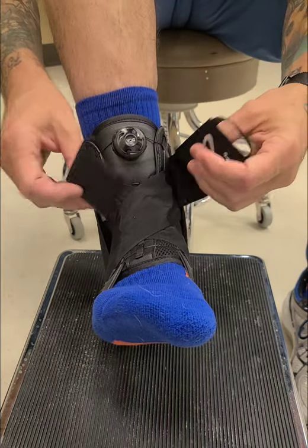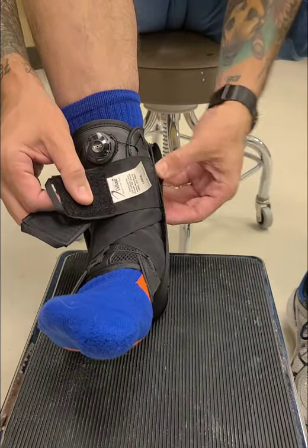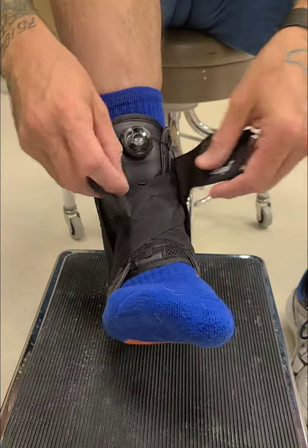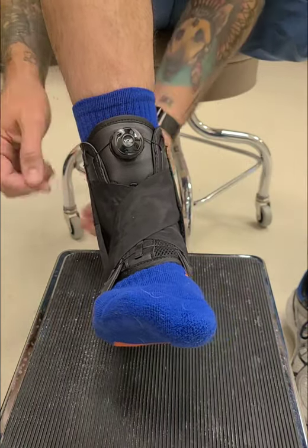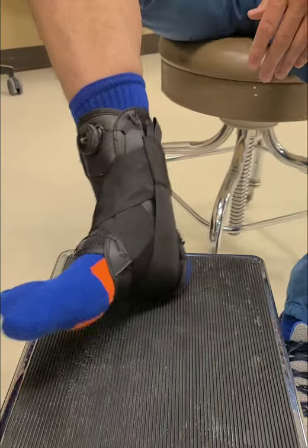And then these two little straps finally have a purpose — they cover up the main straps so they don't catch on stuff. They go to the back: sticky side first, and then you lay the soft side right on top. And that is your BOA ankle brace.